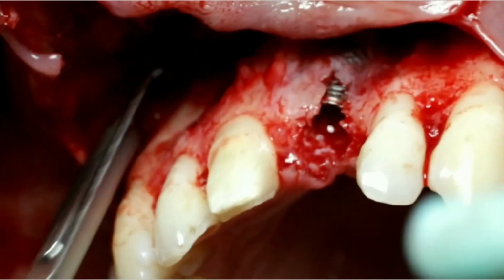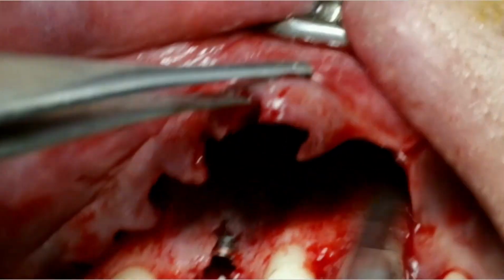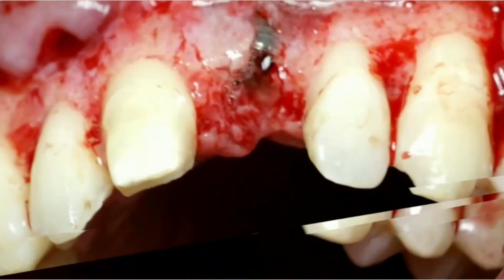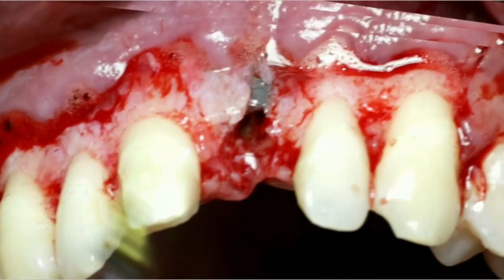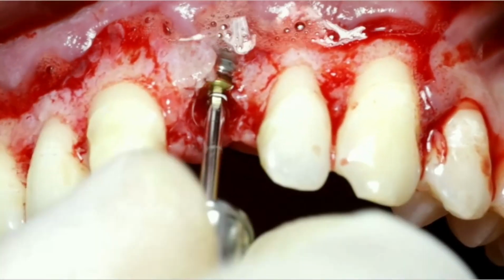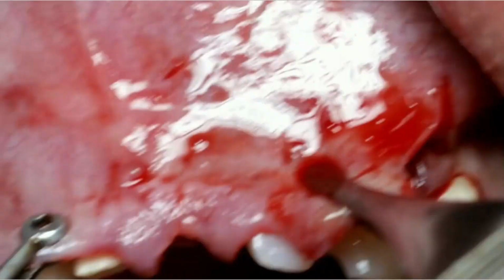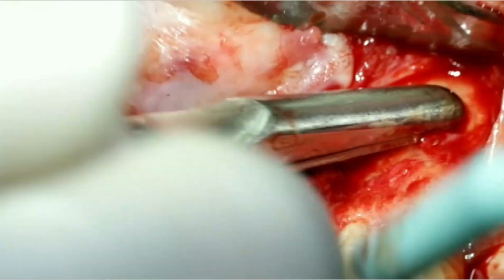Horizontal releasing incision, so our flap will be tension free. And start the augmentation procedure. Autogenous bone harvesting by bone scraper.